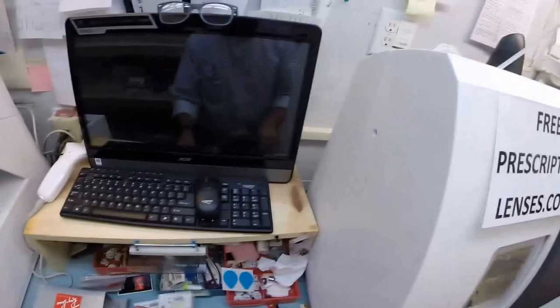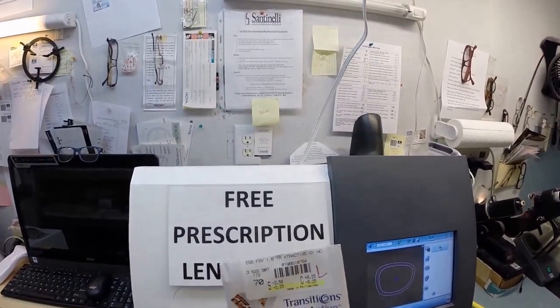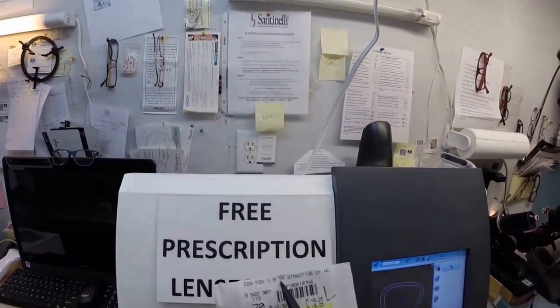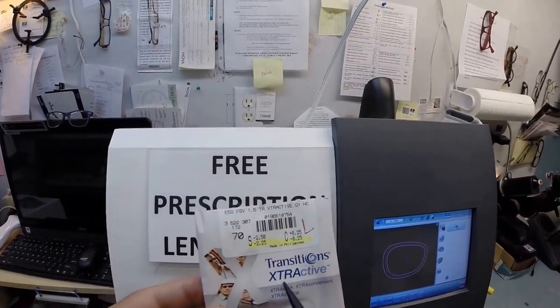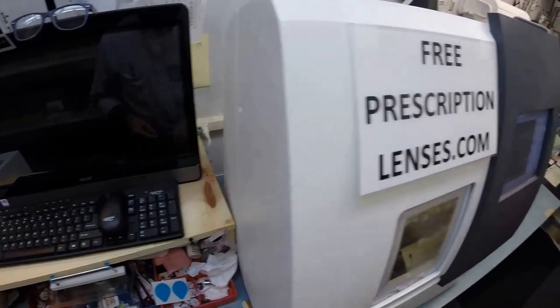Again, your lenses are Essilor 1.5 which is plastic, transitions extra active, GY stands for gray. Of course, transitions extra active, and all transition lenses come with UVA and UVB protection. We know what the sun's harmful ultraviolet rays can do to your skin - well, your eyes are eight times more sensitive than your skin, so you have permanent sunscreen for your eyes that never needs to be reapplied unlike the lotions, creams, and sprays that need to be reapplied every couple hours when you're in intense direct exposure to the sun. Now it's tracing the lens again just to double check its measurements - the old carpenter saying measure twice, cut once. Your lens is completely flat all around the edges like a nickel. I could take it out and it would stand up on the counter. Now it's getting the bevel applied to the lens so it stays inside the bevel of the frame.